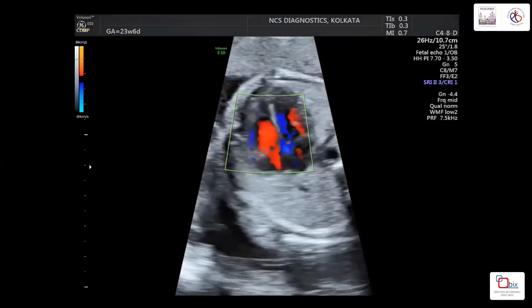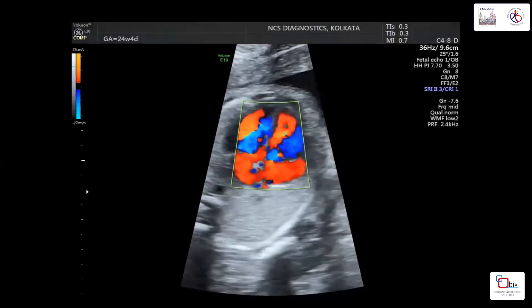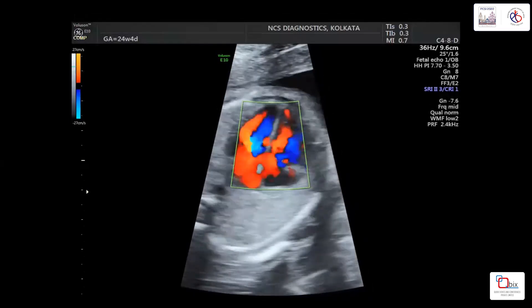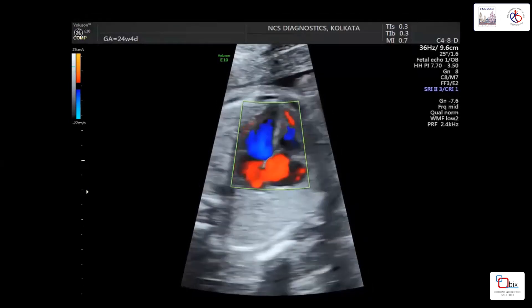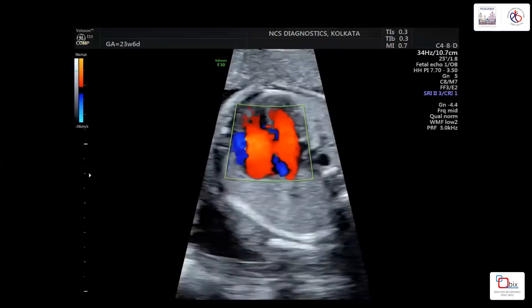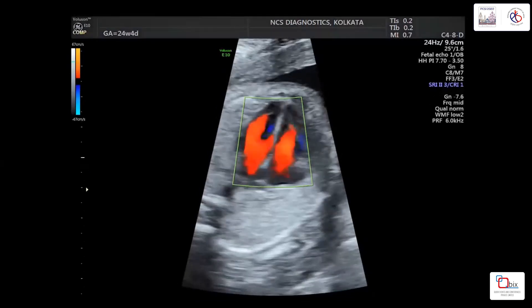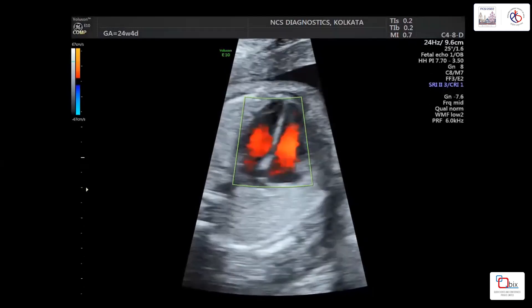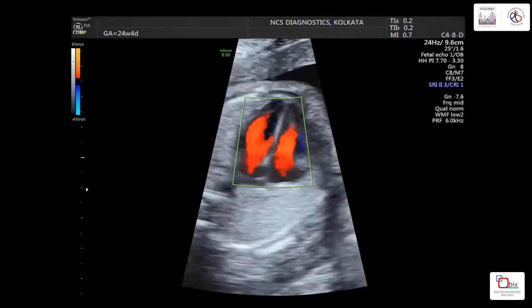With a very low PRF, it is difficult to differentiate any color movement — aliasing appears everywhere and we cannot see the valves or the interventricular septum. Slightly increasing the PRF, and then increasing further, restricts the color to only the cavity, so we can now see the movement of blood flow through the valves.